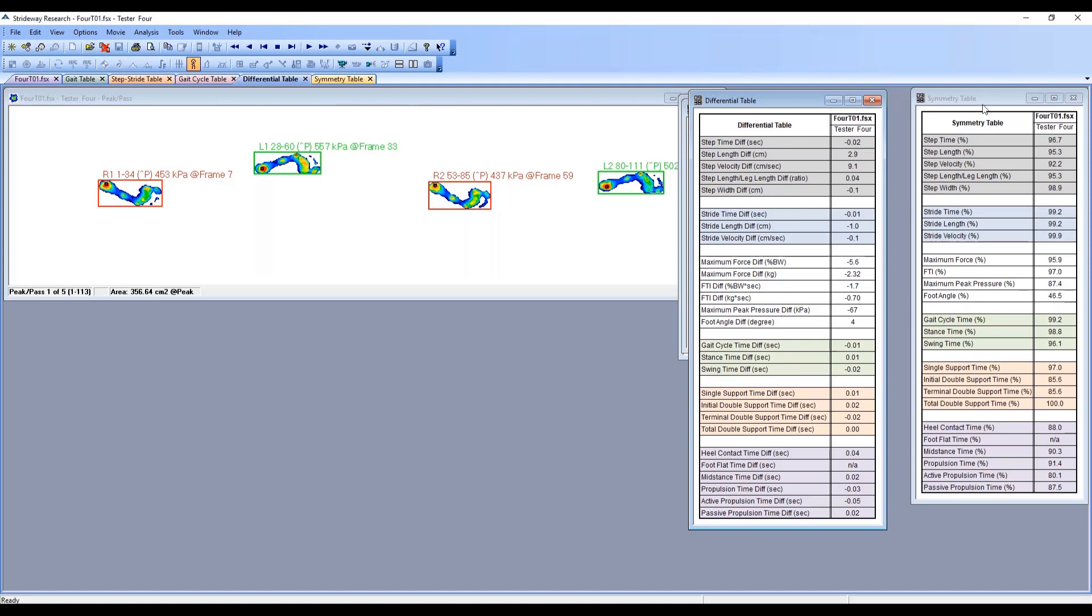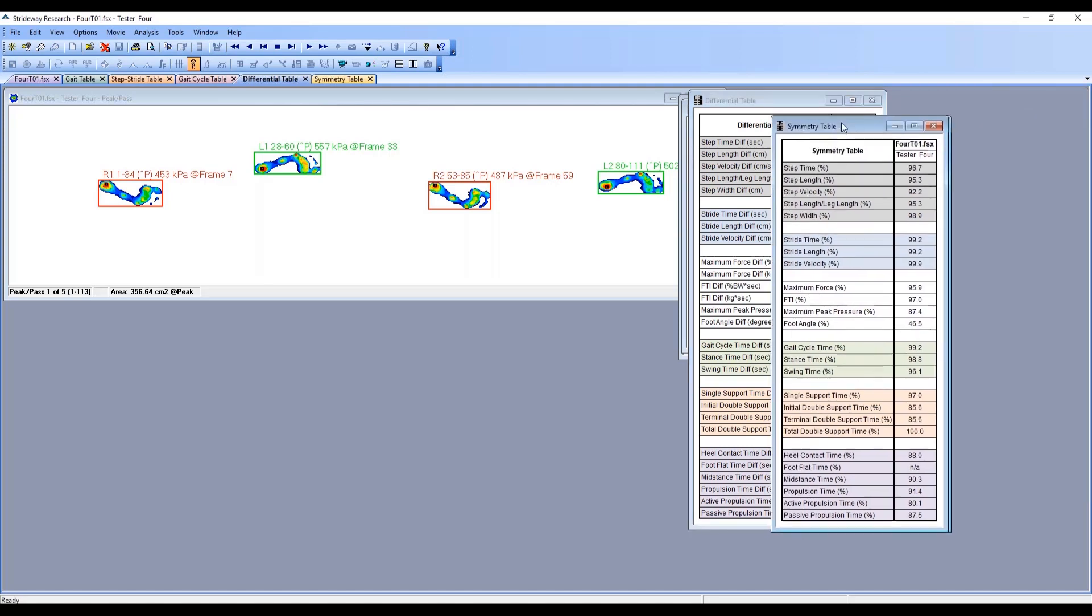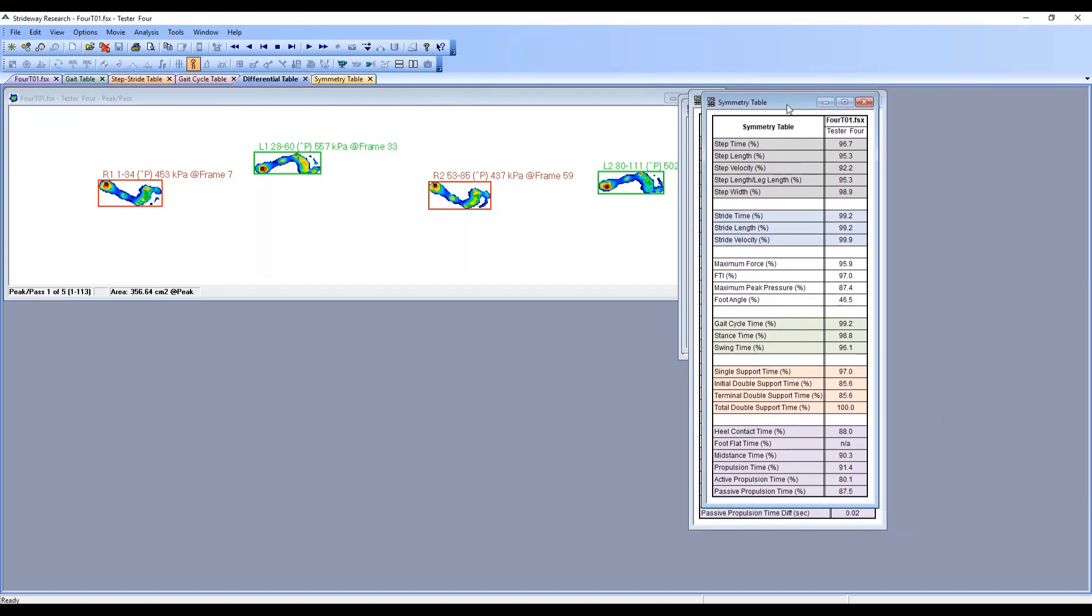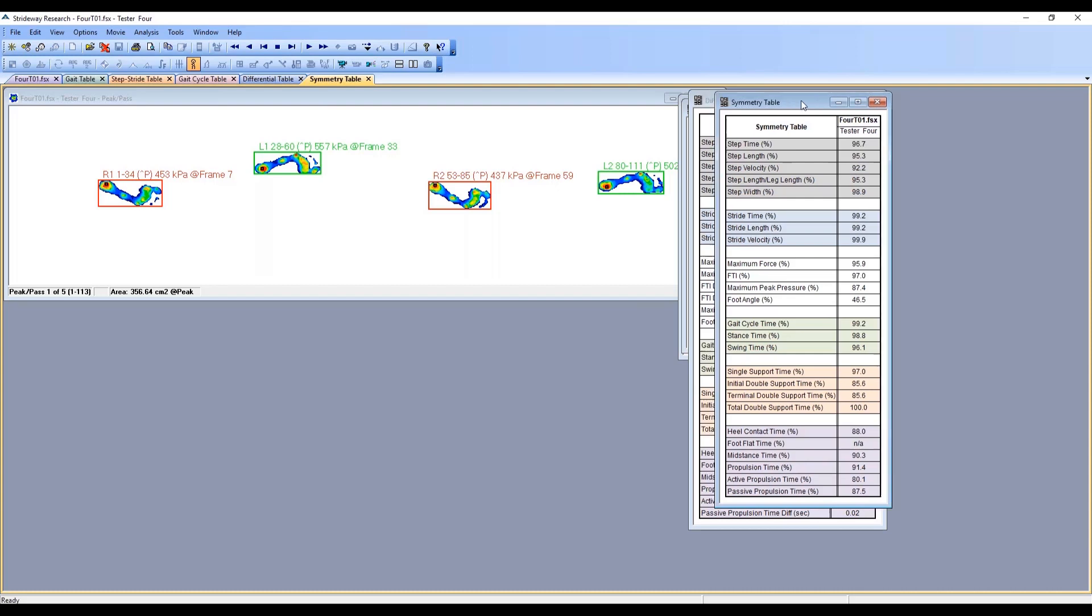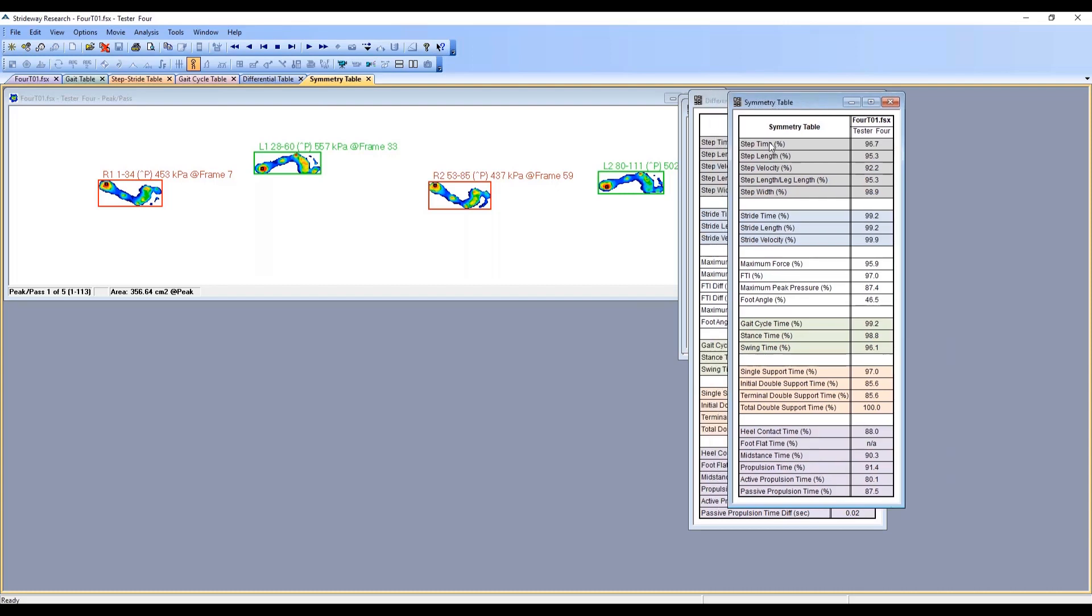The final table is our symmetry table. It's basically doing a calculation of the difference between the left and the right where 100 would be perfect symmetry. As you get smaller and farther away from 100, you are getting more asymmetry between these variables.